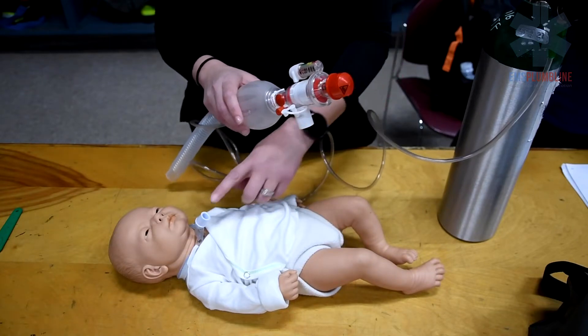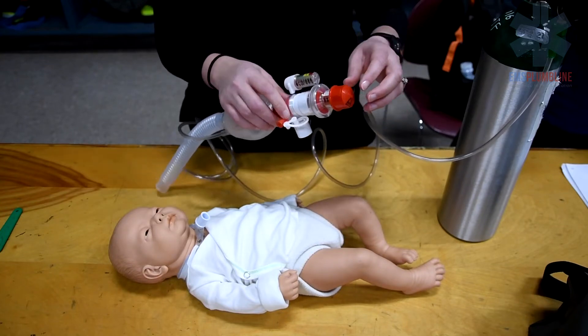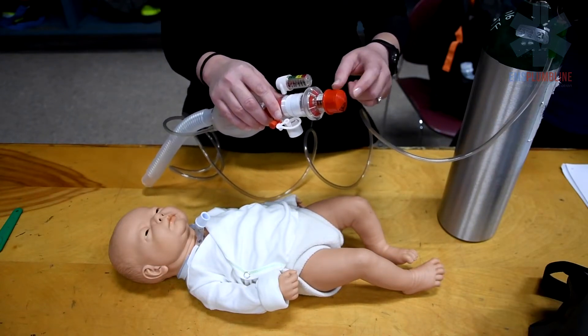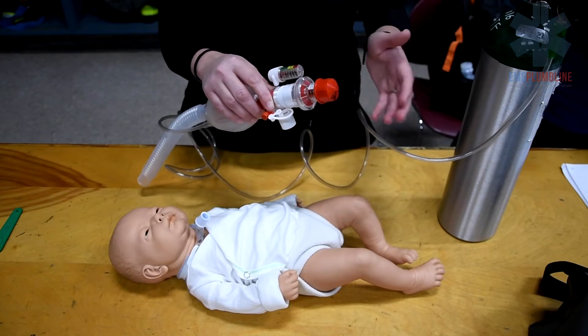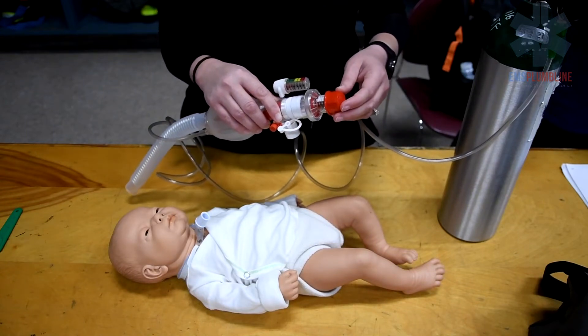The Ambu bag fits directly onto the end of the trach tube. If you are not using the child's Ambu bag, an adapter may be needed. Parts of the Ambu bag include the PEEP valve, pressure gauge, and pop-off valve. These can be important when ventilating a patient with a tracheostomy and/or ventilator, as some children require specific lung pressure to ventilate adequately.